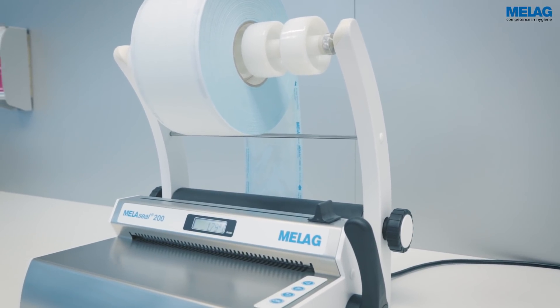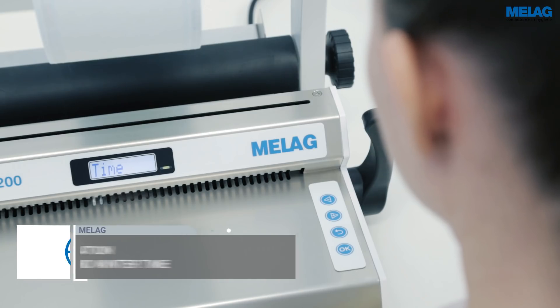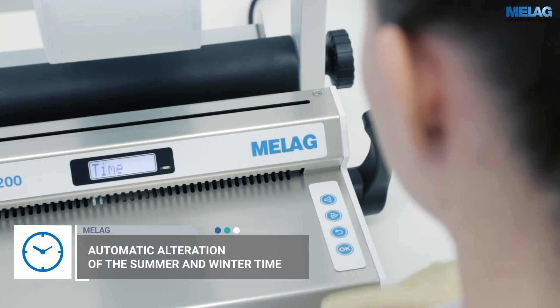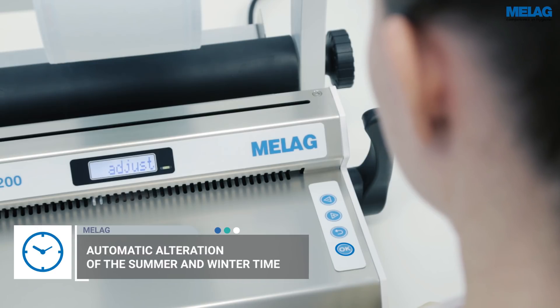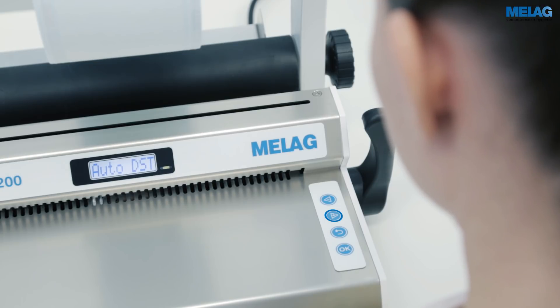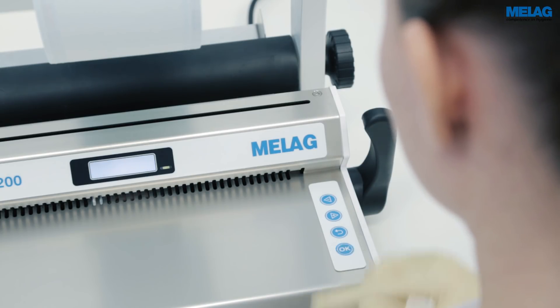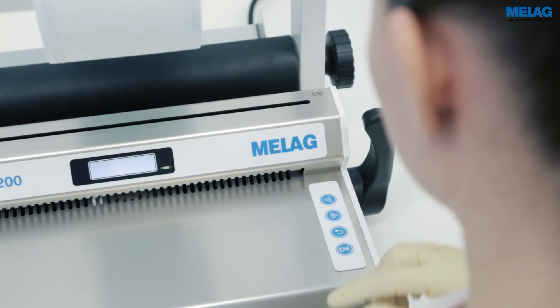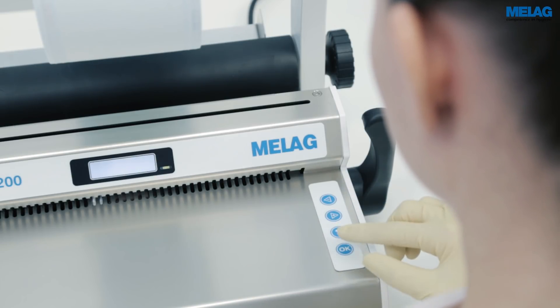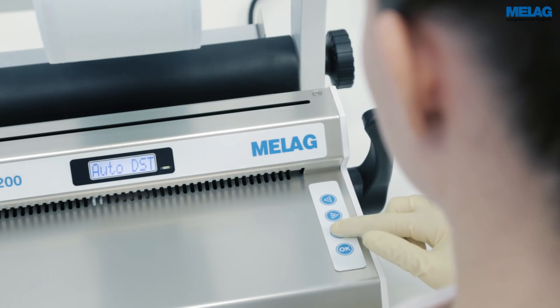The MieleSeal 200 adjusts to summer and winter time automatically. If you want to deactivate this function, confirm the time display notification with OK. Pressing the plus key changes the display from Adjust to Auto DST. Please confirm the menu item by pressing the OK key. Afterwards, deactivate the automatic time changeover by using the plus key. Finally, save the settings with the OK key and return to the Start screen using the curved arrow key.